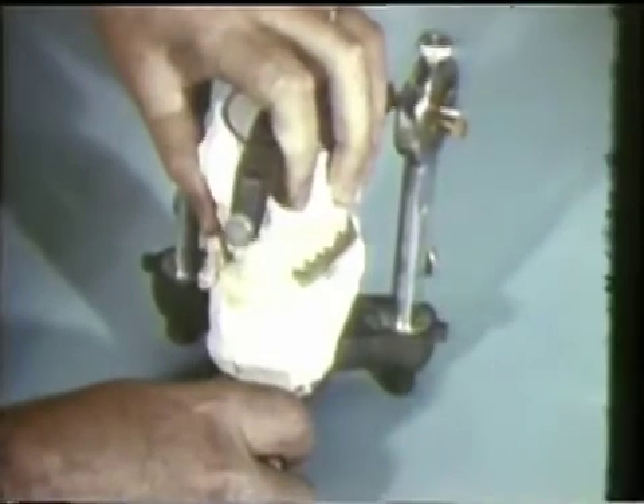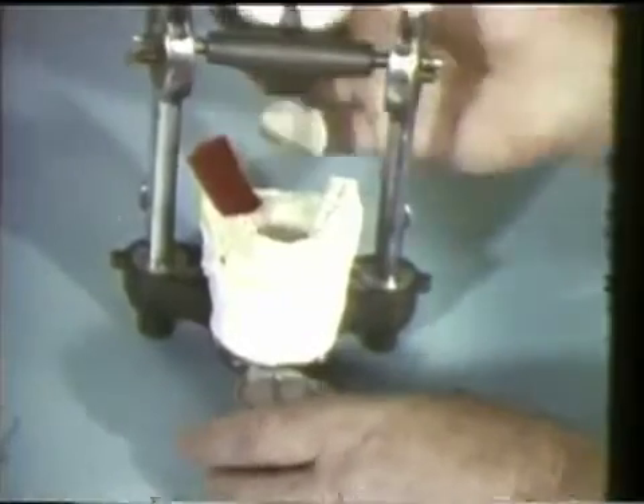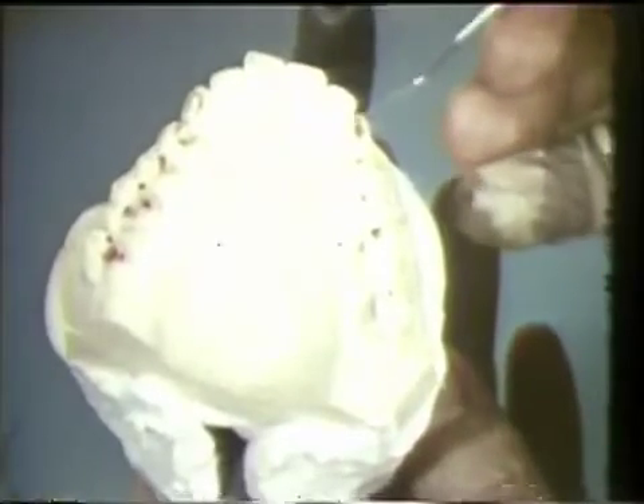Left lateral movement is then repeated on the articulator. The working side contacts are on the left cuspid and the left first molar, while the balancing contact is on the right second molar. The left lateral movement is repeated on the articulator with red dental ribbon. The rubbing contacts are seen on the left cuspid and first molar of the working side, and the balancing contacts are against the right second molar. In the mandible, the working contacts are against the cuspid and first molar, while the balancing contact is against the right second molar.